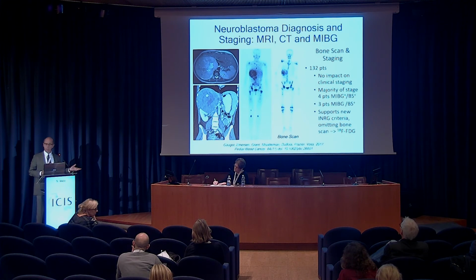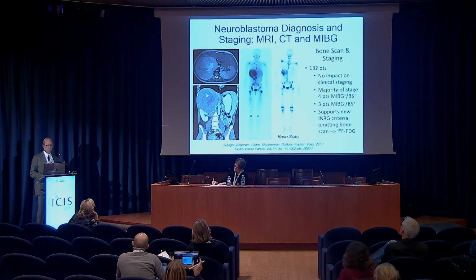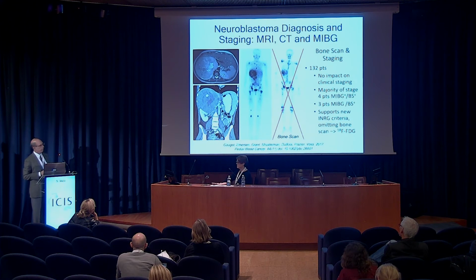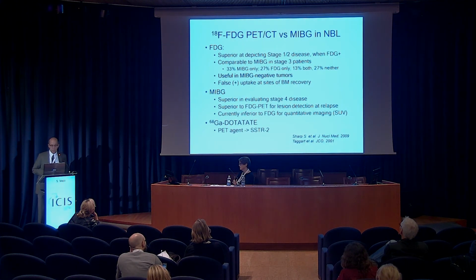Do you need a bone scan? That's a question that keeps coming up. We keep seeing patients referred to our center with bone scans. We looked at this a few years ago. There was no instance where a bone scan upstaged the patient. The patients were, if they were stage 4, they were stage 4 for some other reason, either MIBG or marrow. So the INRG criteria also recommend omitting a bone scan in favor of PET scan for those patients who are MIBG negative.